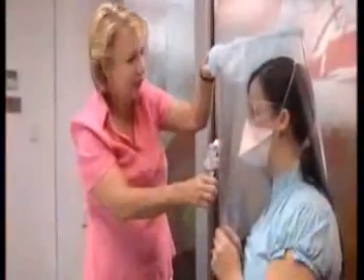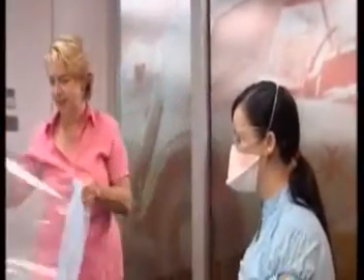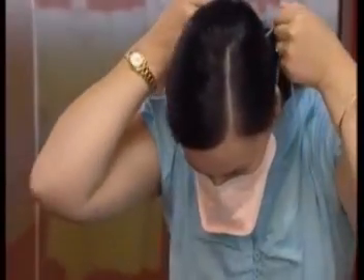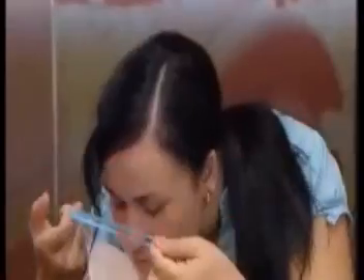Document the fit-test result and place it in the employee records. The employee should be provided with a record of the fit-test result, including details of the brand, model and size of the mask fitted, and a sample provided so they can practice the correct procedure for putting on and removing this type of mask.